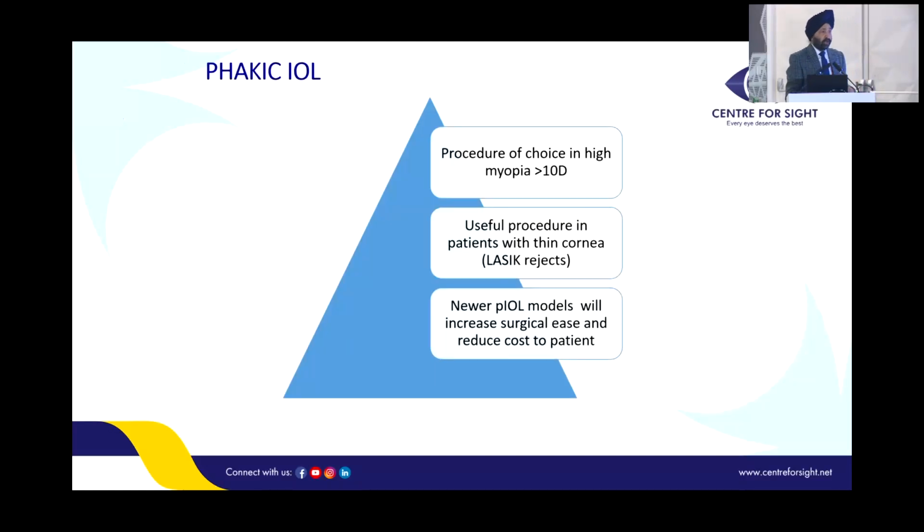So friends, these are some of the things that you have to note in the immediate post-op or during the surgical period. And post-op as regards cataract, removing the cataract is not a very difficult thing. Overall, I would rather go in to have a cataract rather than an ectasia. It's much easier to treat a cataract than to treat an ectasia.